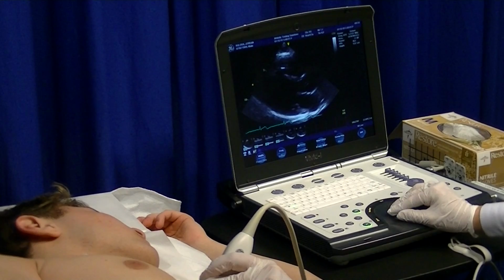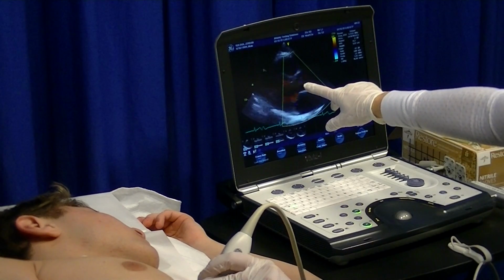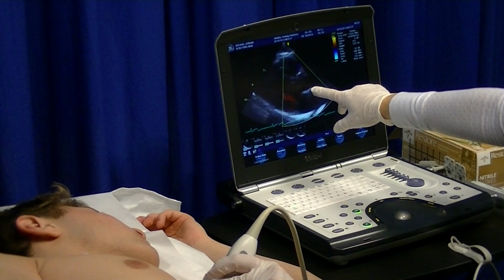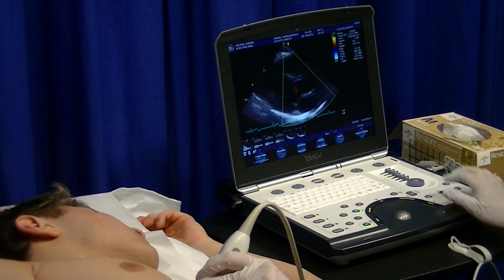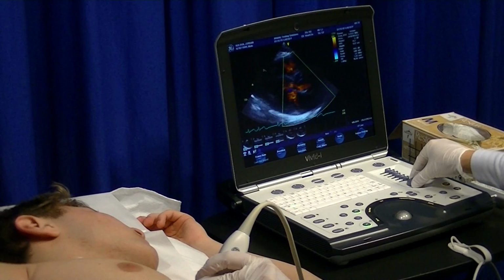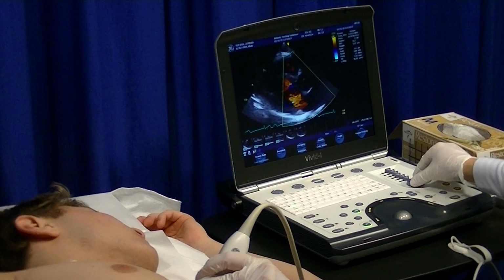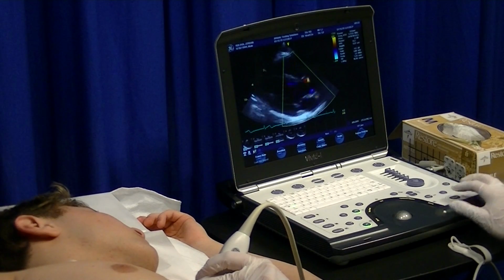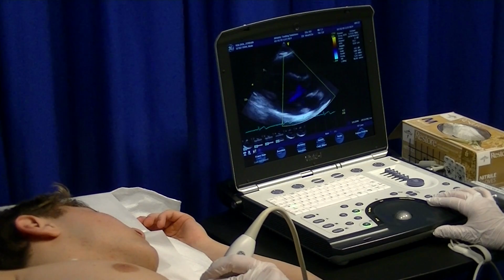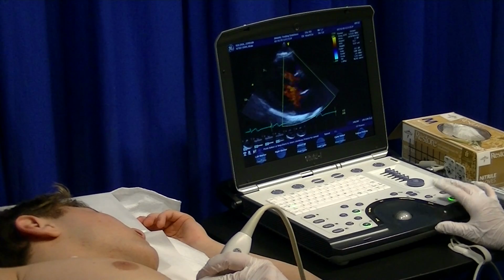Next, we're going to place color flow over the two valves. Here we can also investigate for any kind of peri or supramembranous VSDs closer to the aorta. We would like your color flow to have as much fill as possible without being speckly or flashy. So you want to increase your gain just below speckle. And again, you're going to just watch 3 beats go by and then hit store. Approve your loop and hit store again.